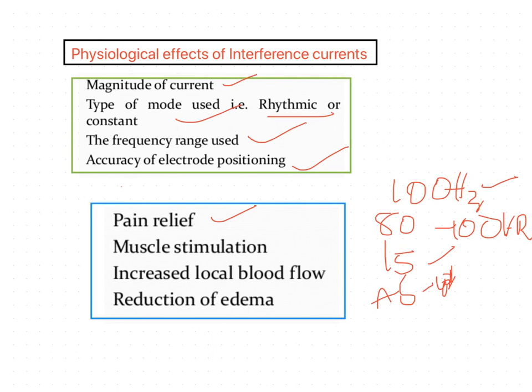And muscle stimulation. Normally innervated muscles will be made to contract if interferential frequencies between 1 to 100 Hz are used. The type of contraction depends on the frequency of stimulation, as the shape and length of each individual stimulus is of a muscle stimulating type. At low frequencies, a twitch is produced between 5 and 20 Hz, which leads to a partial tetany, and from 30 to 100 Hz it produces a tetanic type of contraction.